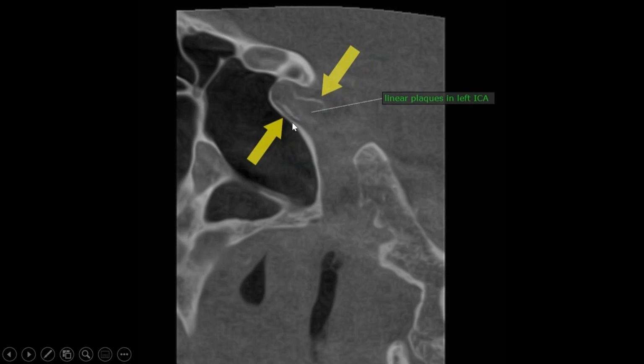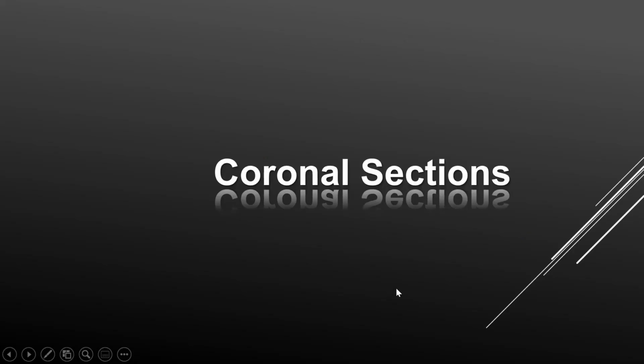So if you see parallel lines in this kind of region, this is sphenoid sinus, adjacent to the sella, it is medial arterial calcification, and you're looking at MAC. So there's the path of the artery that it takes. Internal carotid comes up there. You're going to see it, you just hadn't recognized it until now.